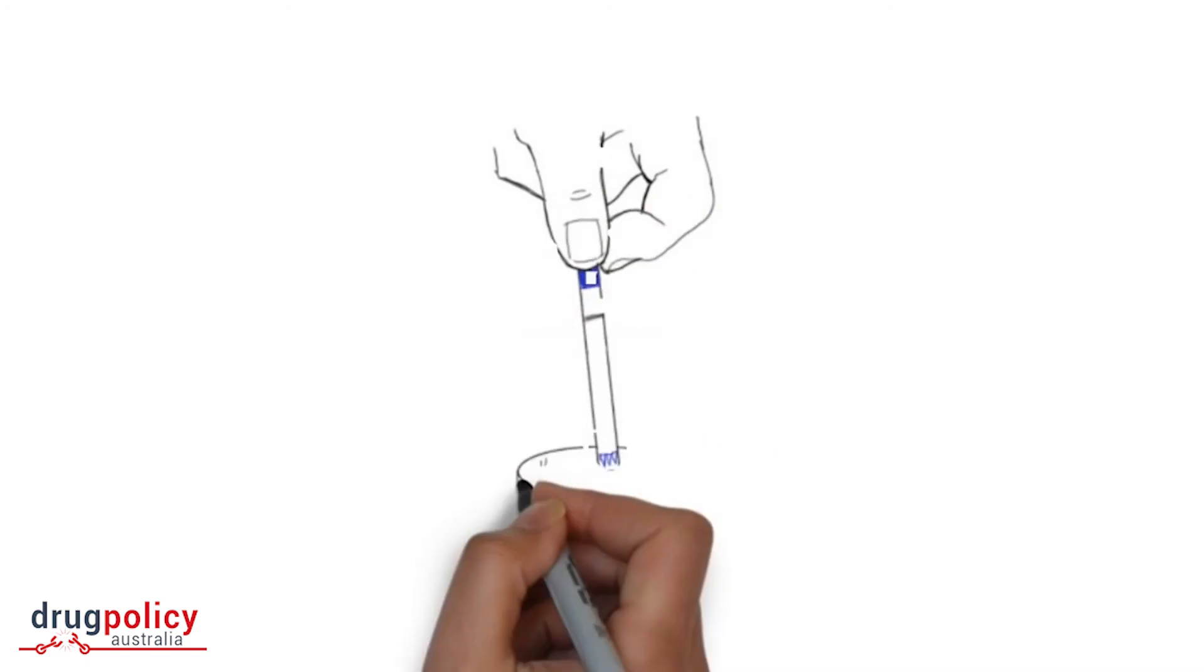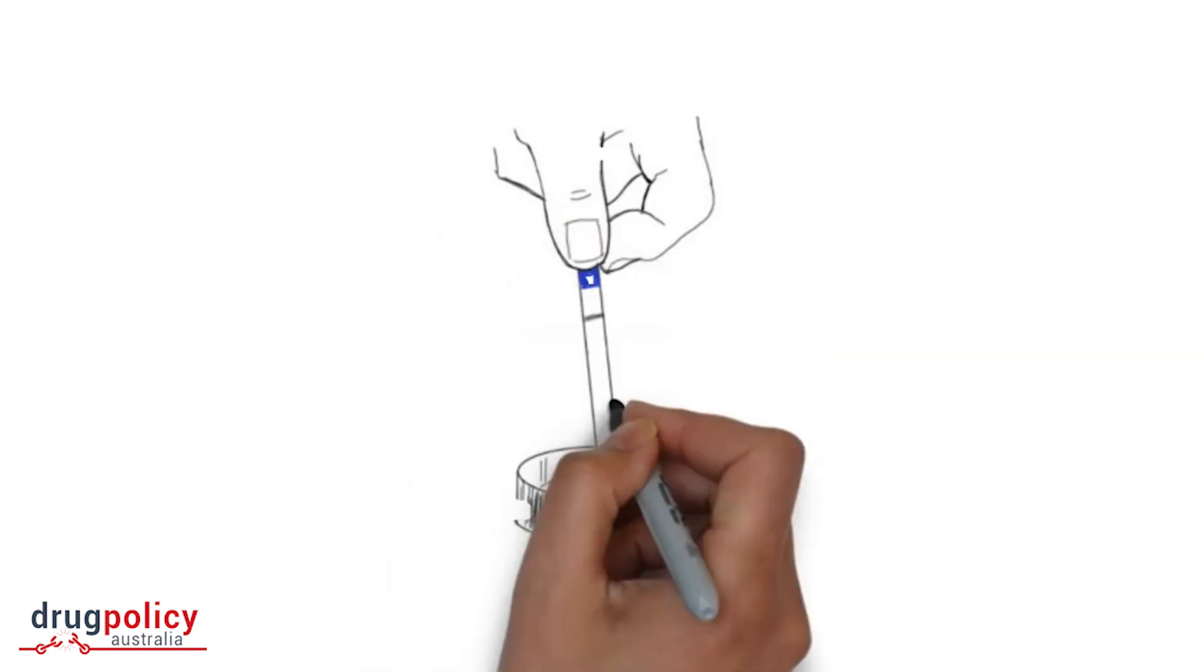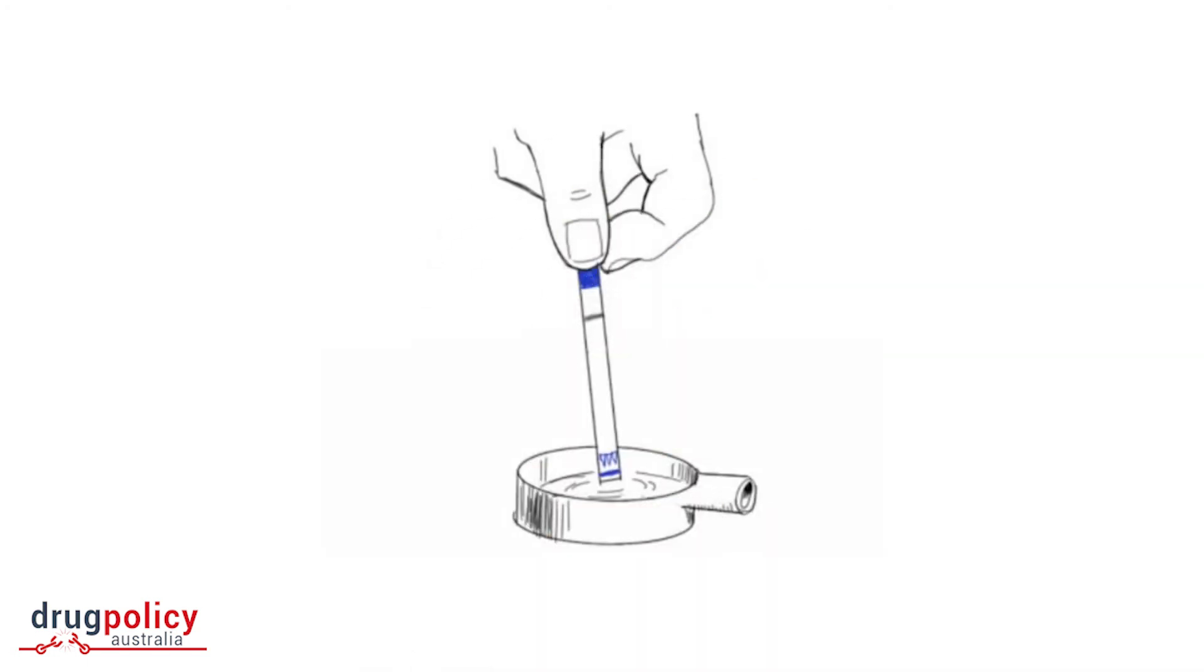Now add a little water back into the cooker. You are going to test the residue. Open a test strip and make sure to hold it by the top. Dip it into the cooker and keep it there for about 15 seconds.